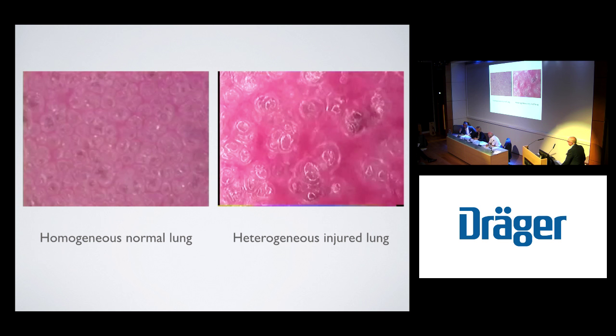And even some older data suggests that if you add a continuous pressure, we can call it PEEP or you can call it CPAP, you may actually encourage water redistribution into the interstitial space and actually improve the lymphatic flow. The key thing, though, is that when you have a continuous pressure like PEEP, one of the key differences, and this is speculation, is that the lymphatics may not dilate. And one of the problems is that if you move the water to the interstitial space, you still need to get it out of the tissue.